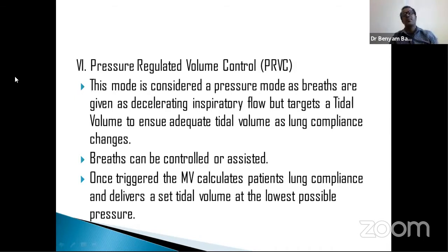So, pressure regulated volume control. This mode is considered a new mode. Usually recently developed mechanical ventilators will have this mode, but you don't expect to find it on every mechanical ventilator. This mode is considered a pressure mode, as breaths are delivered via a decelerating inspiratory flow, which is more like physiology, but it targets the tidal volume to ensure adequate tidal volume is achieved, despite what the lung compliance is.